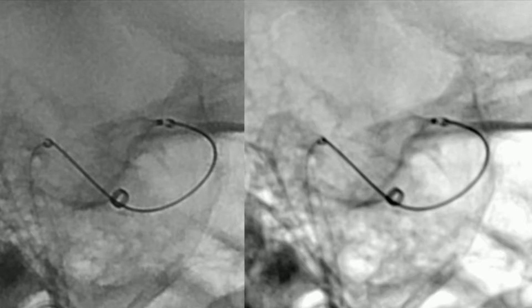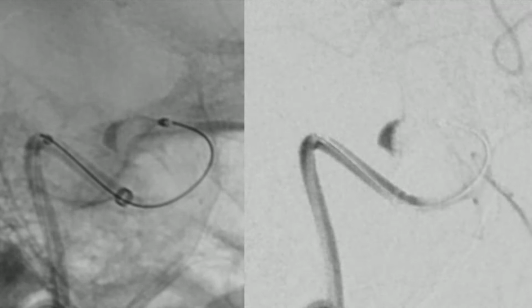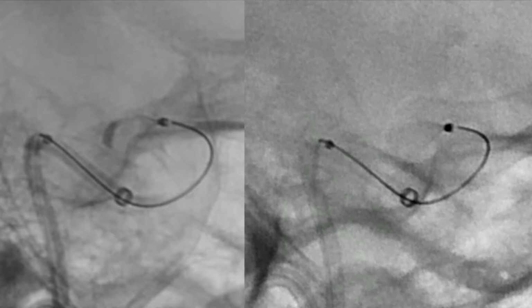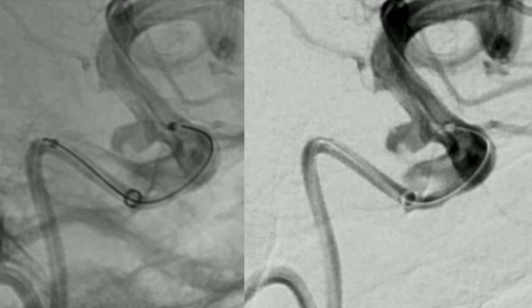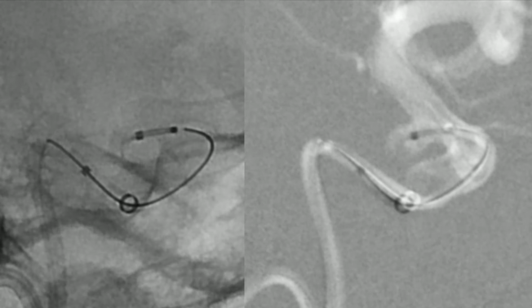And now we perform a 2D angiogram to see, and as you can see, it's a little bit prolapsed in the vessel lumen. It's a little bit big for the aneurysm. We take another projection to see the neck of the aneurysm a little bit better and repeat our 2D angiogram, but as you can see, it's still in the vessel lumen and it's not just a phenomenon of the projection.